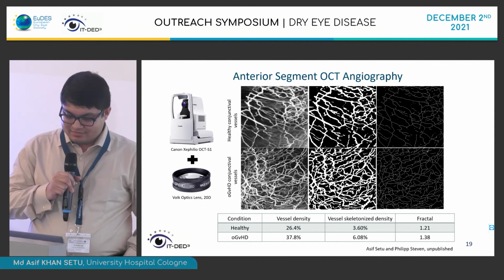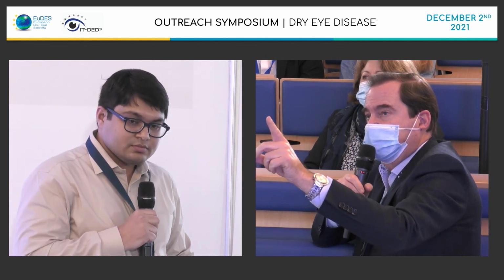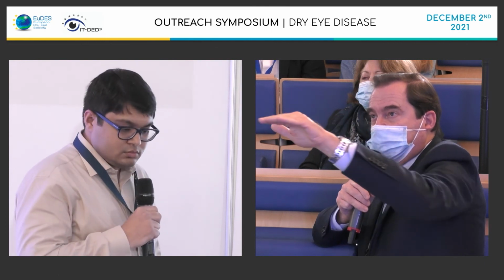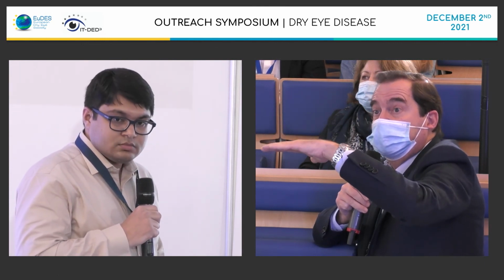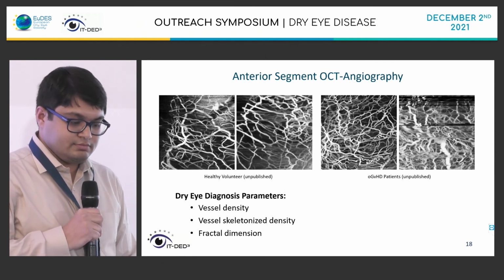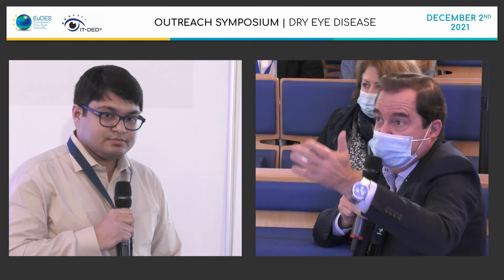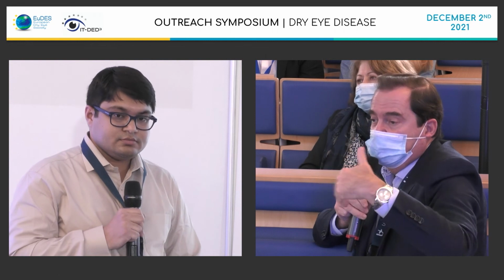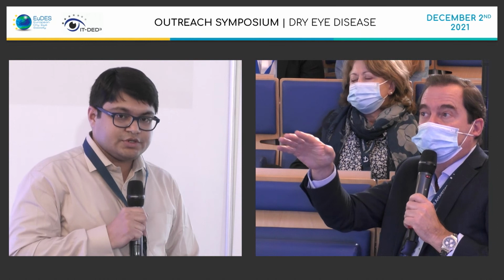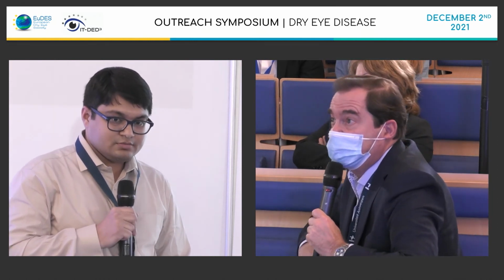Thank you, it's very nice pictures. If you go back to the Heidelberg one, the horizontal lines in fact correspond to the micro movement of the eye. Yes, micro movement of the eye. And it's very difficult because most companies don't develop specific software for compensation. In the retina they have developed eye tracking systems to try to decrease the micro movement, so it's much better. But it's very difficult to get very good images.